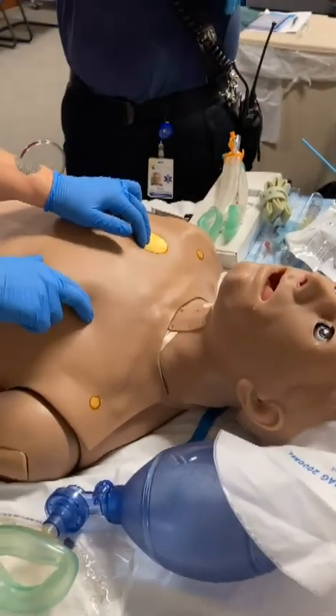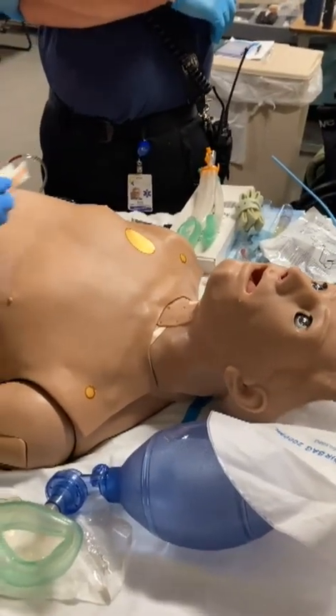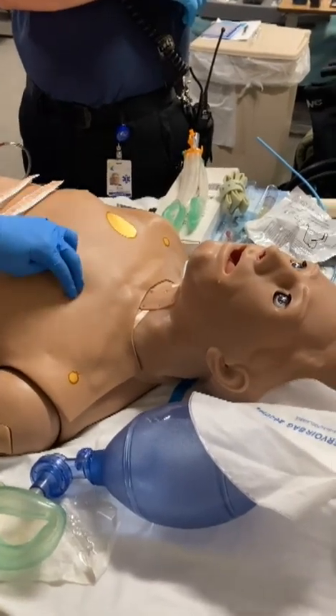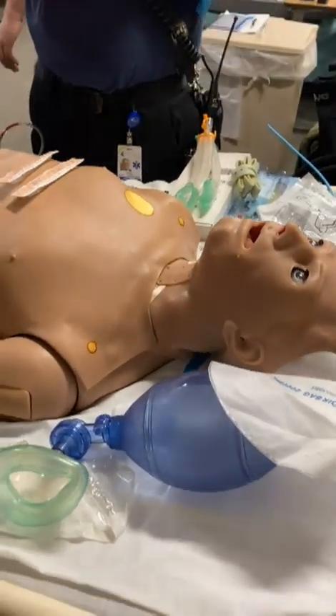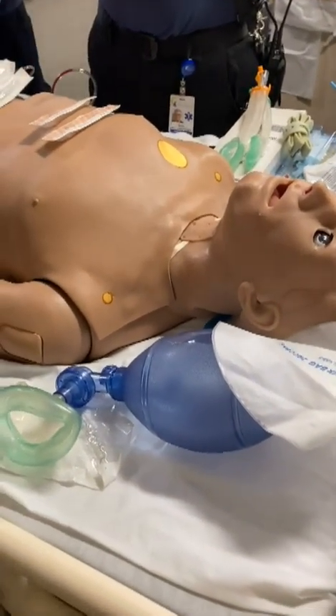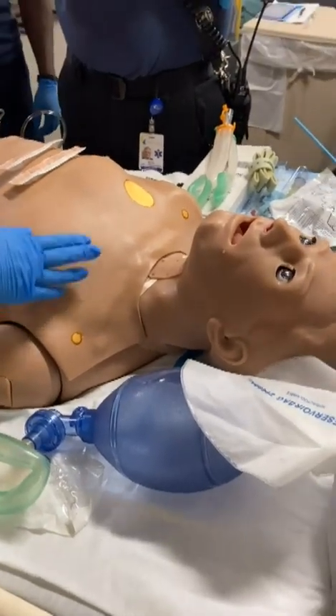On this mannequin we're not doing fifth and sixth — we're going to stick to just the mid-clavicular. For our purposes we have size 14 gauge, which is typically what we're going to use for needle decompression. We also have those tactical spears which are much more efficient and compact — better for our needle decompression. So what are the indications for us to do a needle decompression?